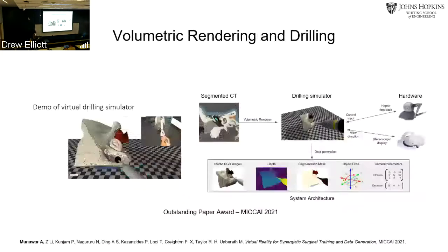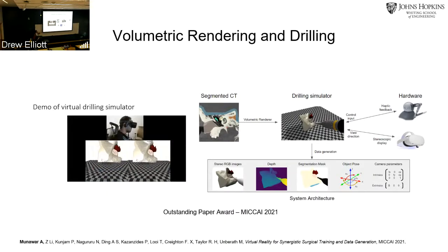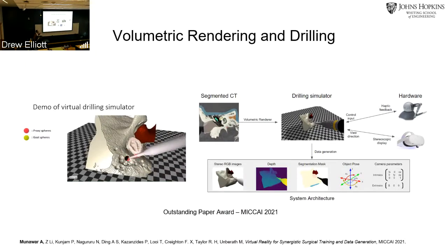The second application is the volumetric drilling and burring project. This project is in collaboration with a bunch of folks from Hopkins, and we are deploying this system at the Johns Hopkins Otolaryngology department so that residents and surgeons can train on the simulator and we can assess their skill. And then we can benchmark the skills of residents compared to trained surgeons.